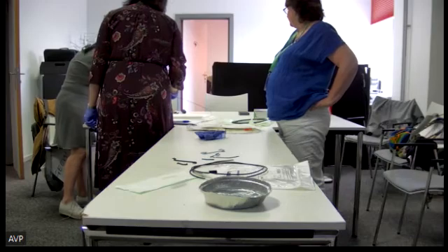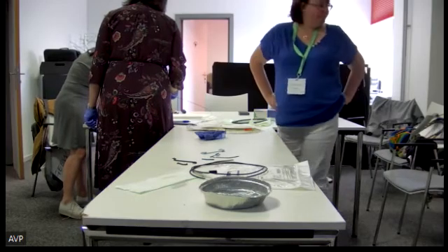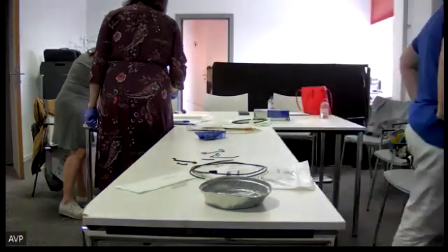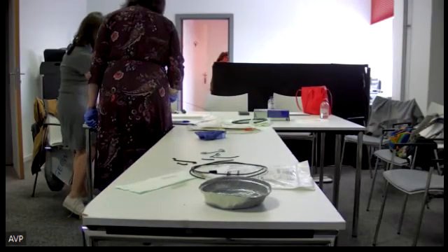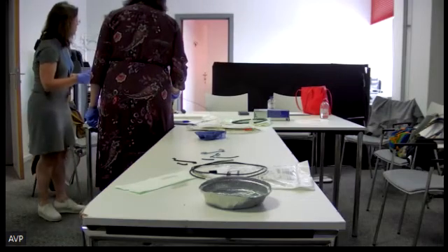Yes, it's a hole. The FNB needles have a different design. They have a tip with three forks like this, and that's what gives more tissue. It's just the needle design.